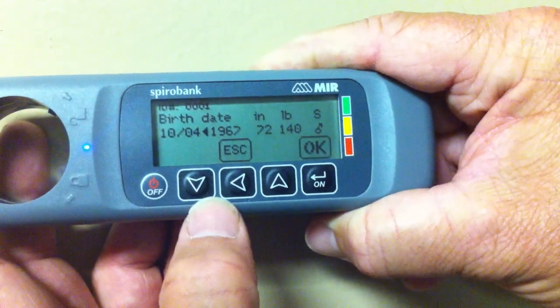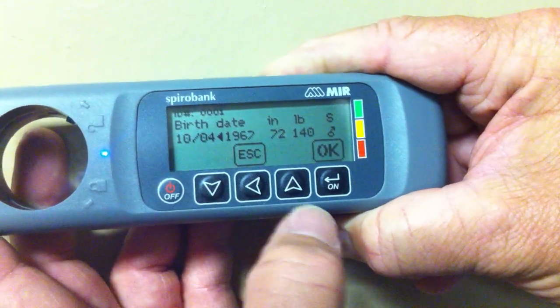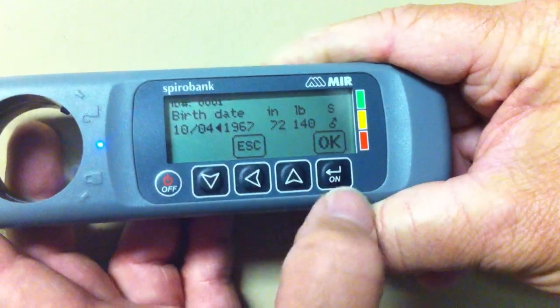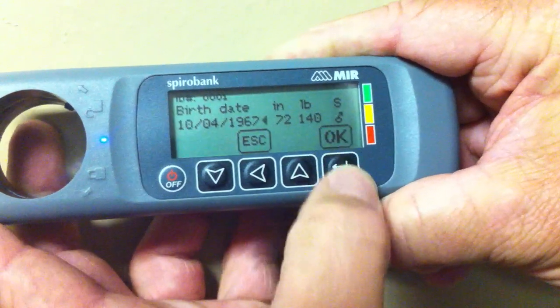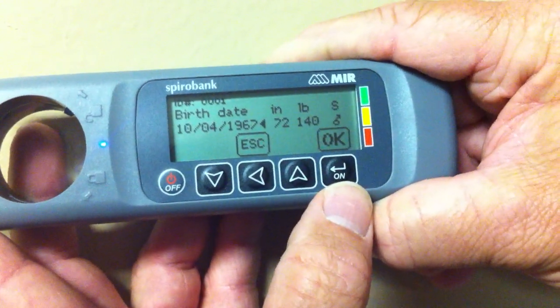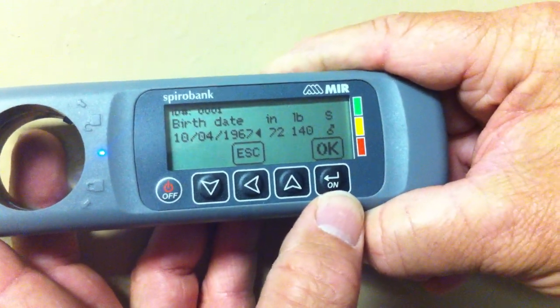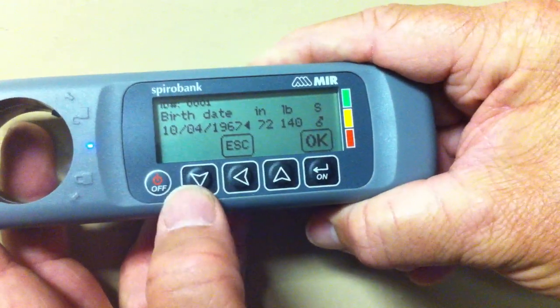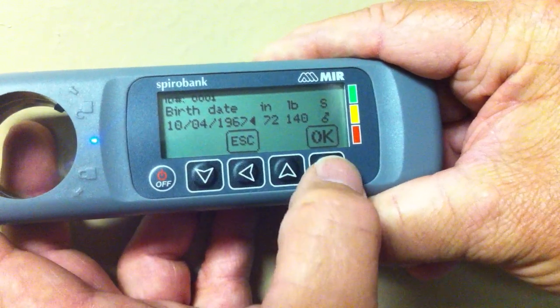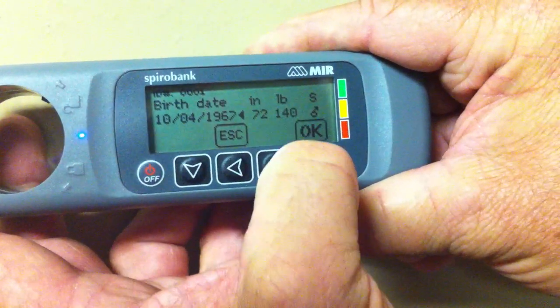Enter the date of the patient using the up and down keys, then hit OK. Next, enter the year of the patient's birthday using the up and down keys, then hit OK.